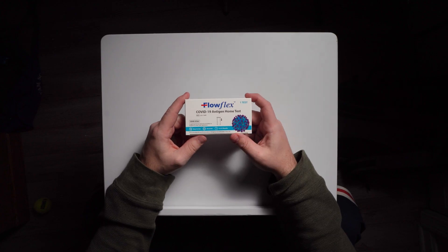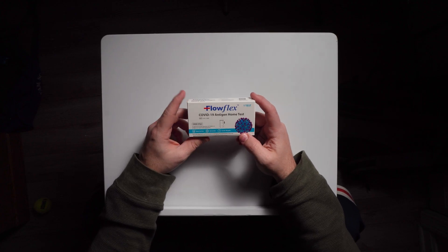Today I'm going to talk about FloFlex. This is a COVID at-home rapid test — a nasal swab, just like the other one I did. If you want to watch the other video, I'll be sure to put a link up above.